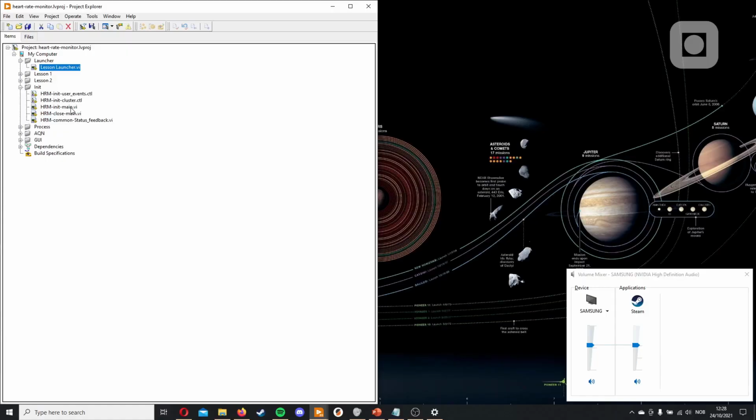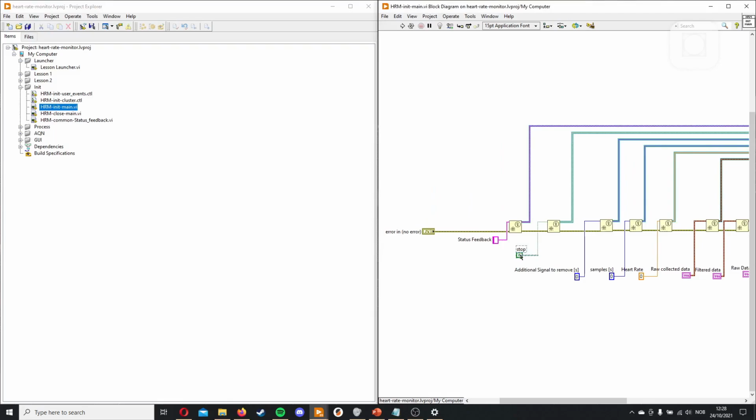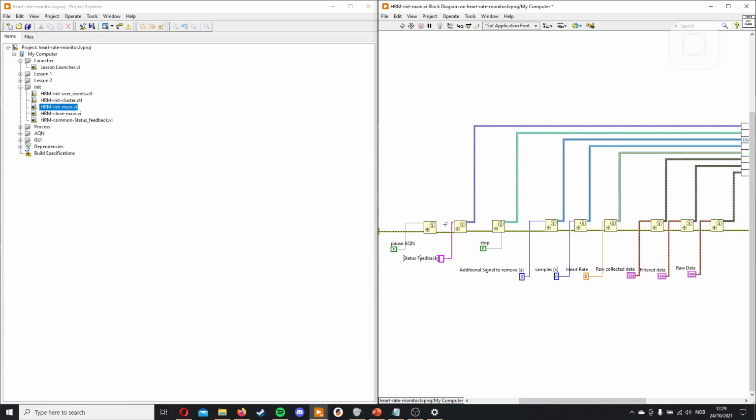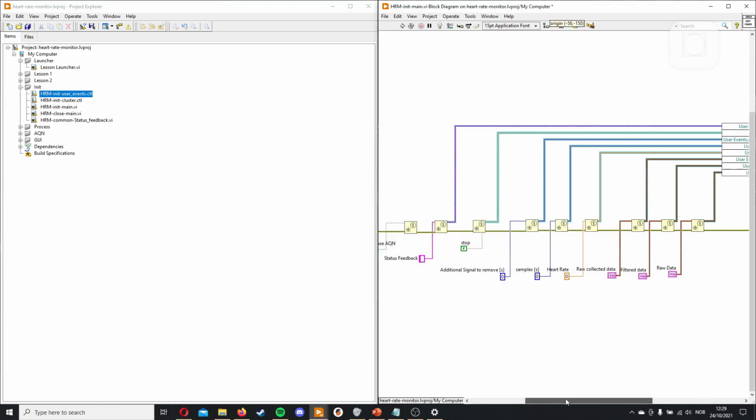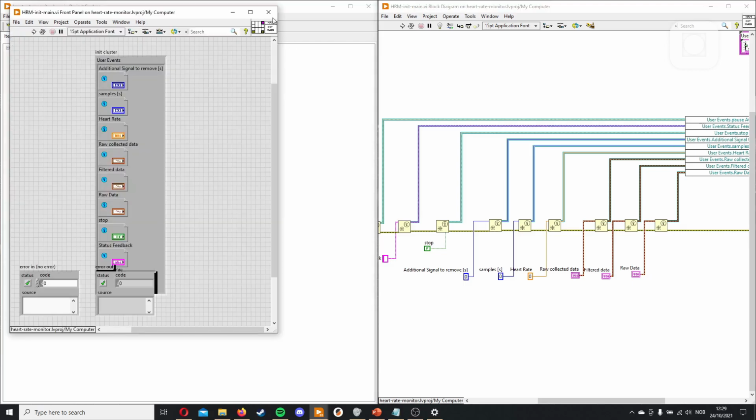We will start as always by adding the user event. It is a true-false user event, so we'll just copy this one. Remember to change the name or else the name will come in the user event and that will be very confusing if that's called stop. And I just mark this and hold Control, press space, and then press W and it auto-wires. And we'll need to add this one to the user events. Now we need to add it to the close.